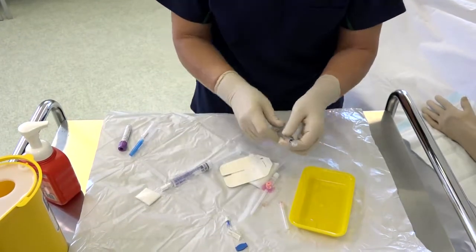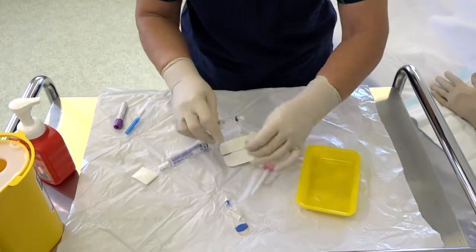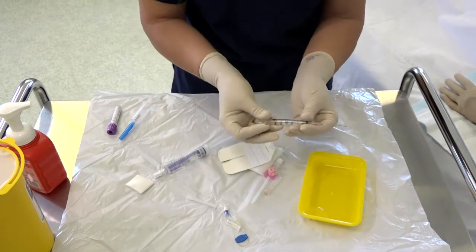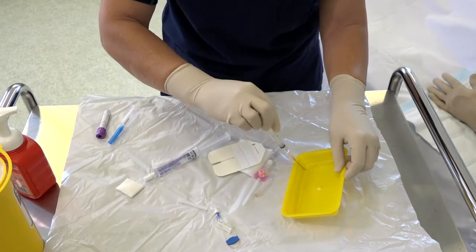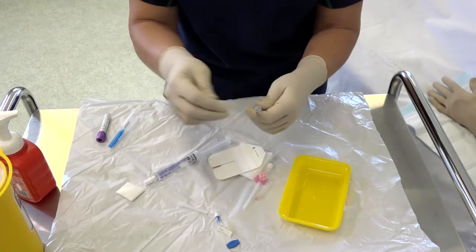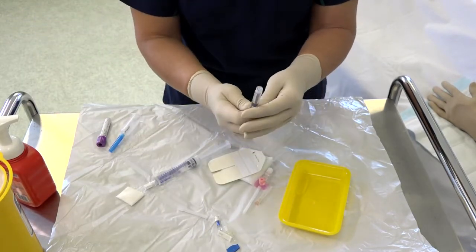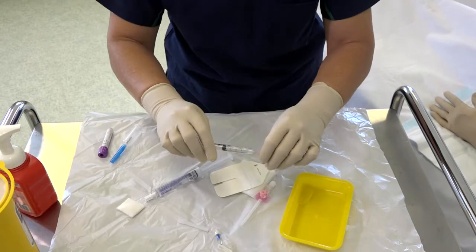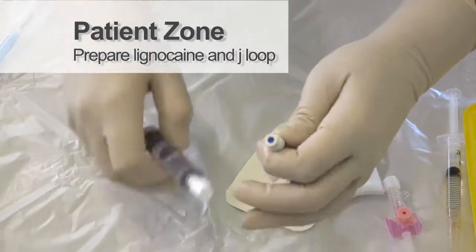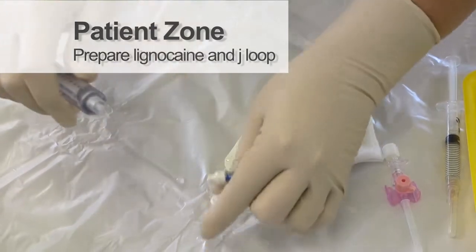Now prepare your equipment. Draw up the lignocaine and attach the needle. Prime with normal saline.